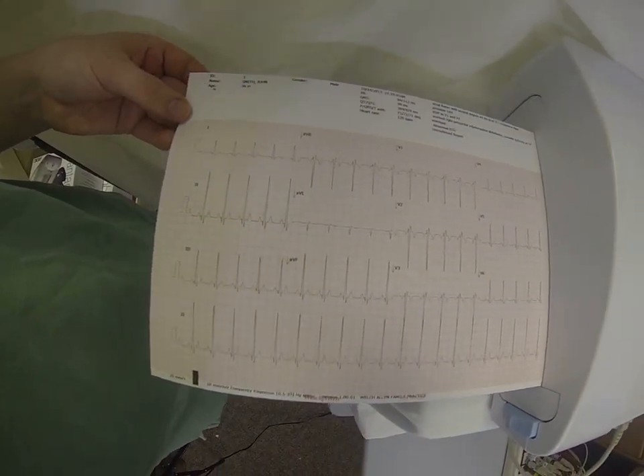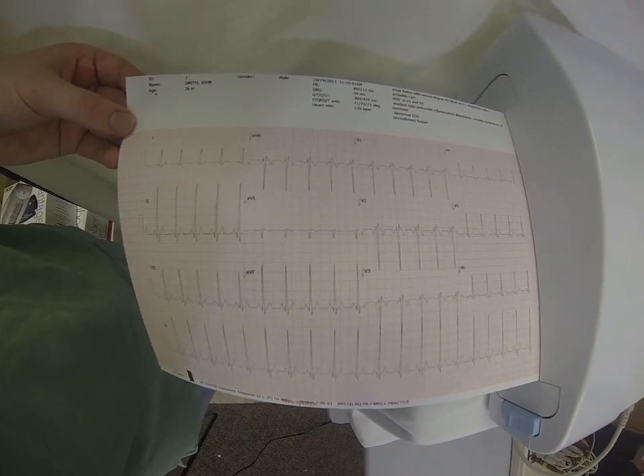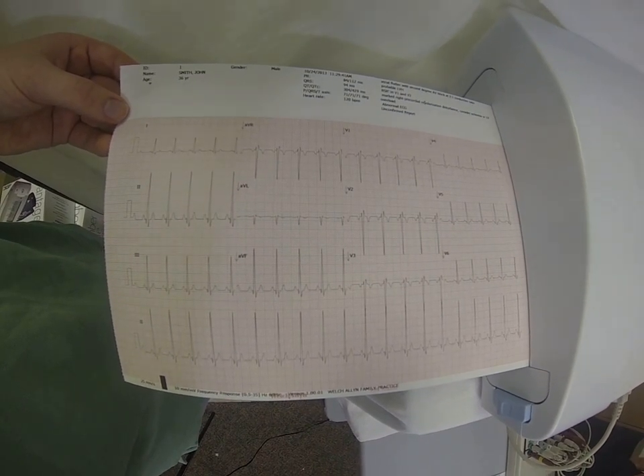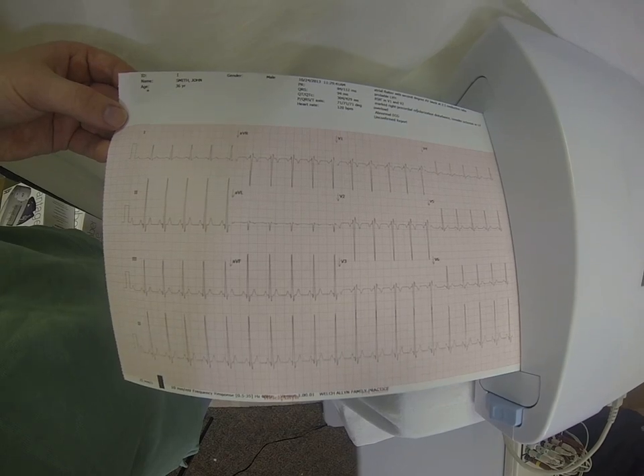There you can see your printout: patient information at the top, interpretation in the upper right-hand corner, your 12 leads, and you'll also get a rhythm strip at the bottom, which defaults to lead II, but that is editable as well.